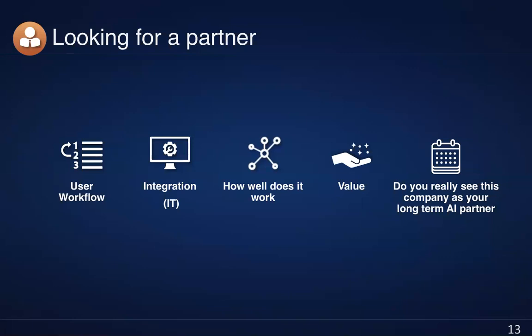The next parameter, which is tightly closed, is the integration and how many resources the integration would entail. Typically nowadays, you would want to make sure to test the AI before, I would say, going full throttle, which means you would probably invest IT resources before any other type of resource. So you want to make sure to reduce that barrier as much as possible.